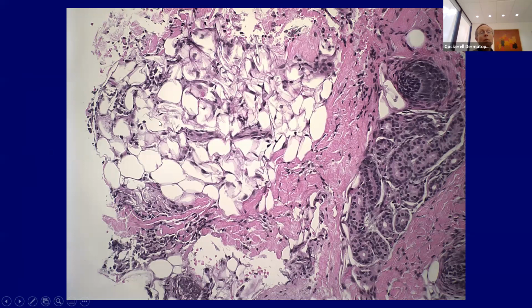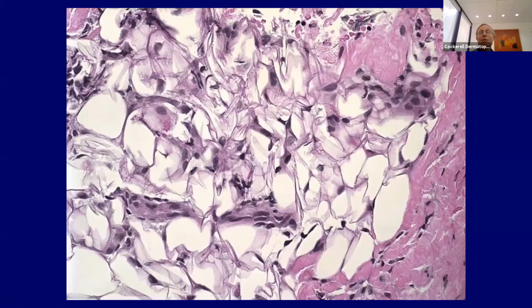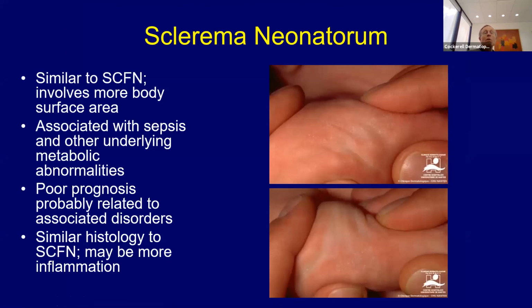And then just like with pancreatic panniculitis or alpha-1 antitrypsin deficiency, when you damage the lipocytes, it can develop secondary inflammation. So this is really primarily an abnormality of the chemistry of the fat, and then you get a secondary inflammatory reaction. This one's got a few histiocytes here and maybe one or two over here, but the main changes are these crystals. Just make sure you're aware of what that looks like under the microscope.